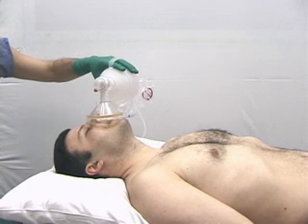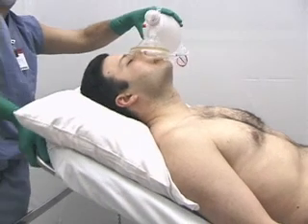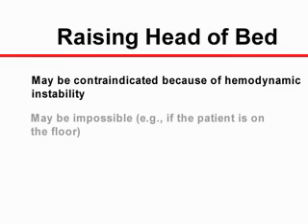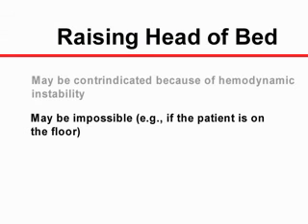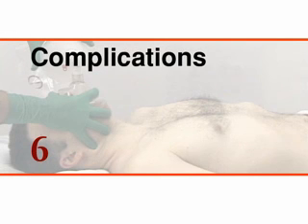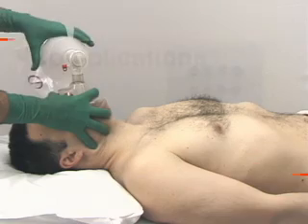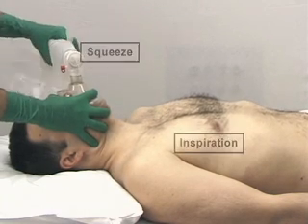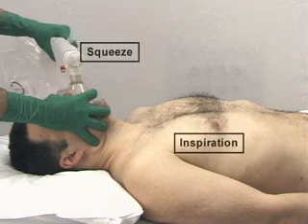Raising the head of a bed may facilitate the delivery of adequate tidal volumes, but may be contraindicated because of hemodynamic instability, or may be impossible, for example, if the patient is on the floor. When the patient is breathing spontaneously, one must synchronize the delivered tidal volume with the patient's inspiration.